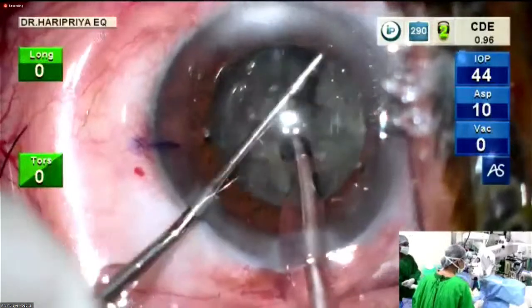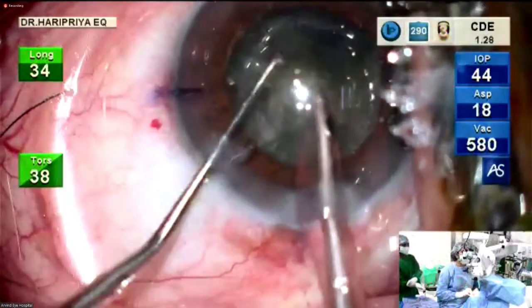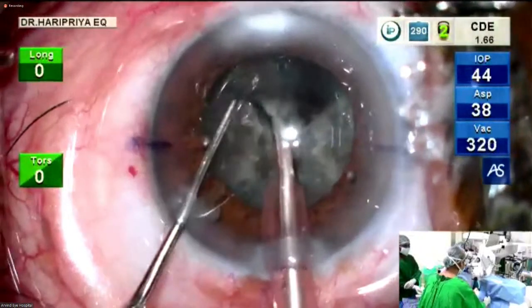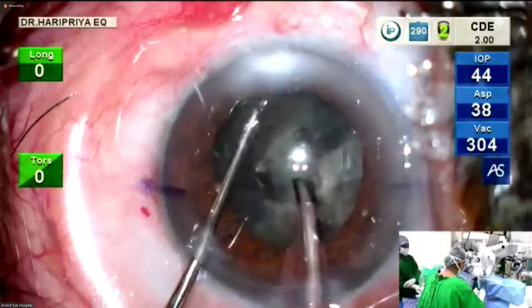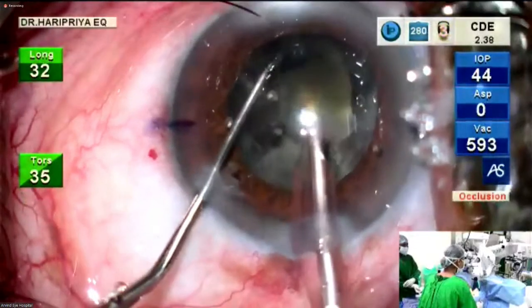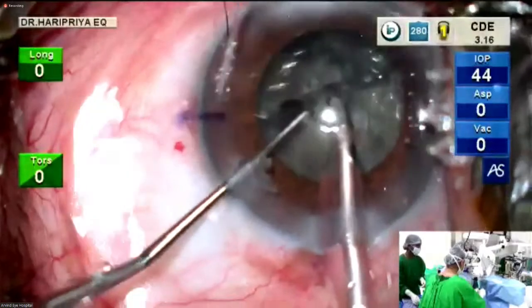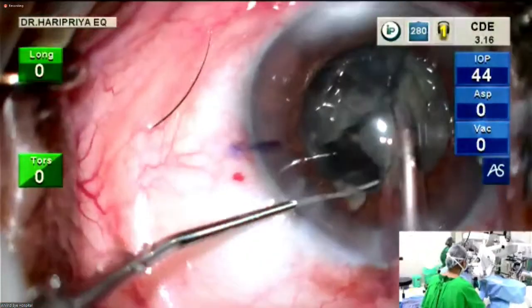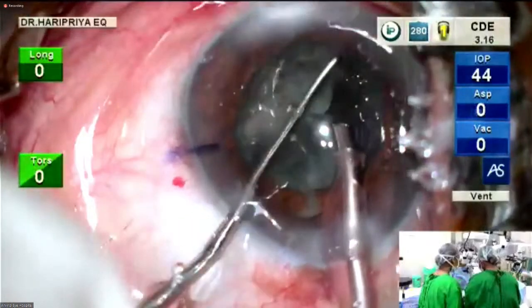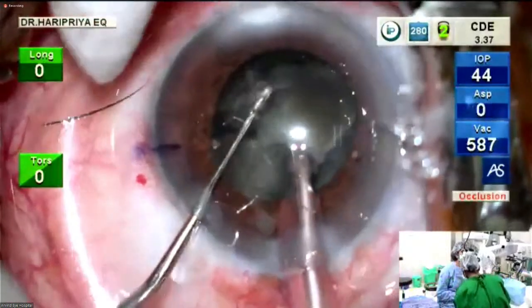In this cataract, you want to have it broken up into as small pieces as possible. Once your pieces are smaller, you'll find the aspiration is much quicker than eating up larger pieces. They kind of disappear into the phaco tip. Though my vacuum and flow rate are higher, I use the same IOP and my chamber is absolutely stable, which means I don't have to go deeper. So you break it up into smaller fragments and then eat it up.